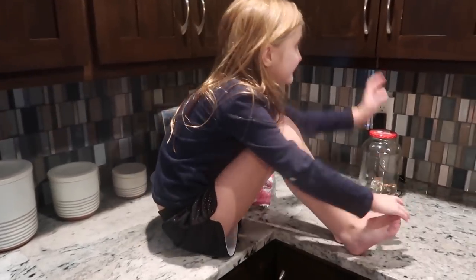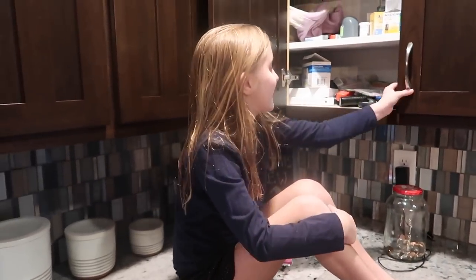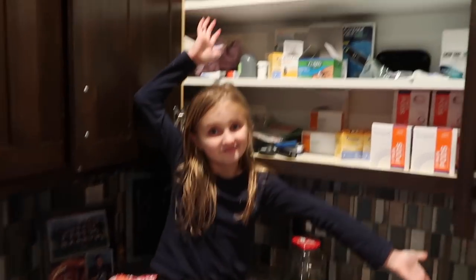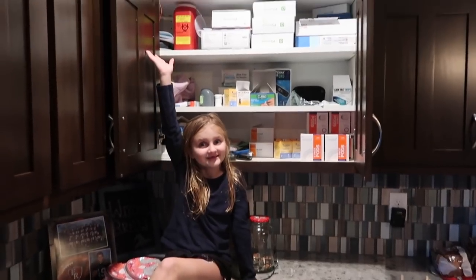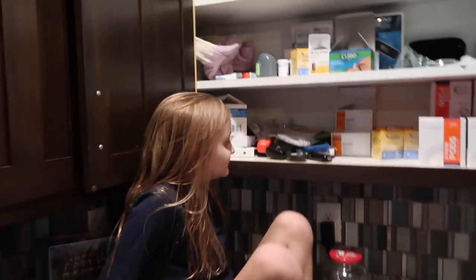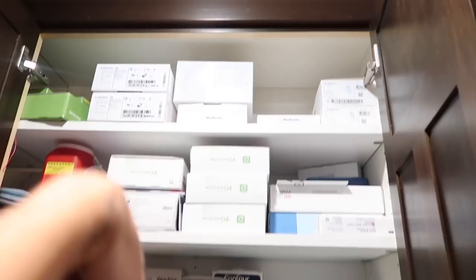Hey guys, today we are doing What's My Diabetes Academy. There's a bunch of stuff in here. Let's explain from the top down.